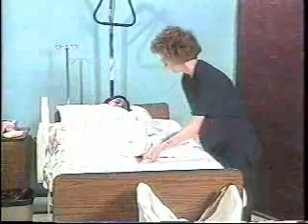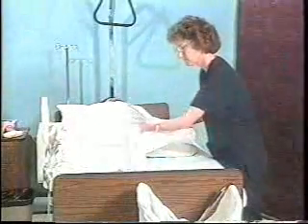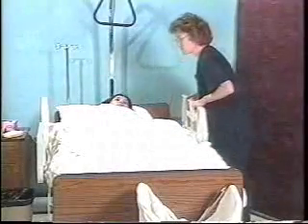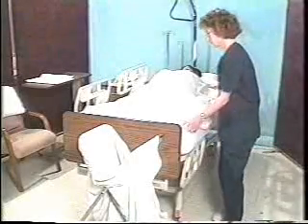The incontinence pad is smoothed over the contour sheet. The caregiver has the patient move to the center of the bed. Now she's ready to put on the clean top linens. The caregiver raises the side rail and moves to the other side.